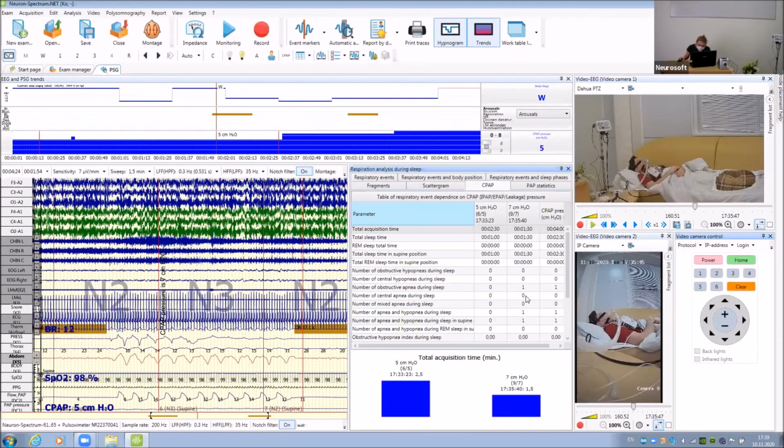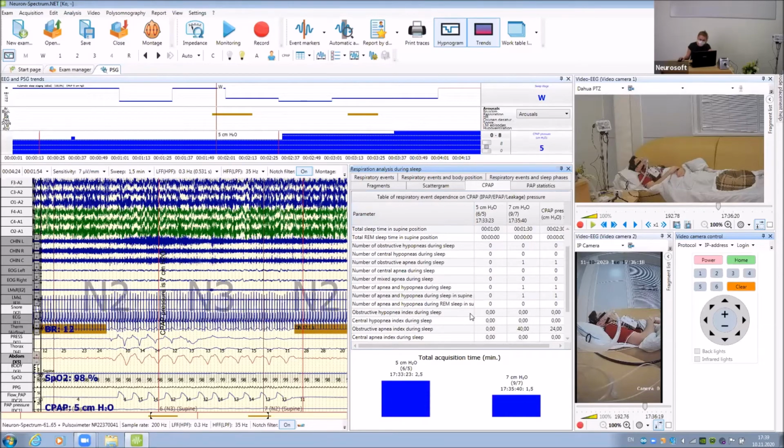And so we can see that the respiratory events go to our tapes, and now we can create the PSG report as we have done it before. So this is the second way how we can transfer information from the pulse device to our systems.